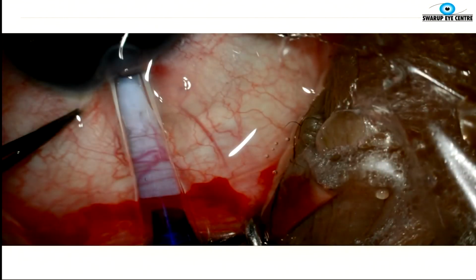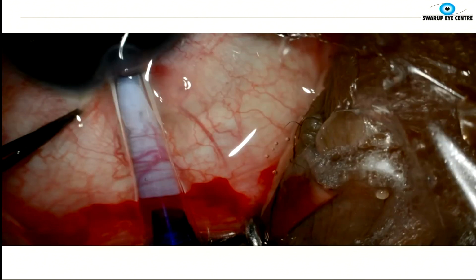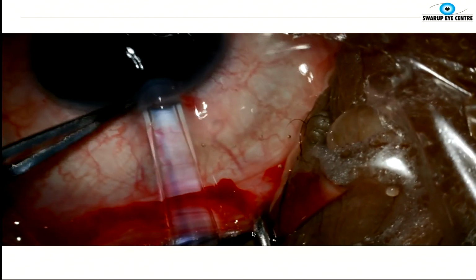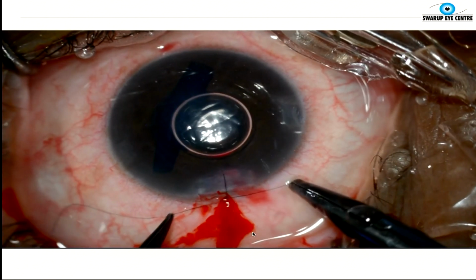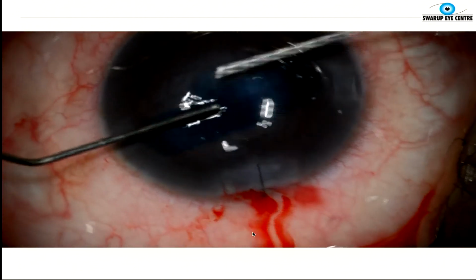And then basically you have to shoot your graft in, I'm sorry, you have to gently inject your graft in. It's important at this point when your graft has gone in that you make sure that the eye is soft. Otherwise, when you come out, the graft tends to come out. Also, you have to give some counter pressure to hold the wound as you're removing your DMEK injector. Otherwise, again, the graft can slip out. I'm sure Ashish will show us some of these complications. It's a good idea to suture these wounds, at least initially. And then, of course, you can start all your tapping maneuvers.